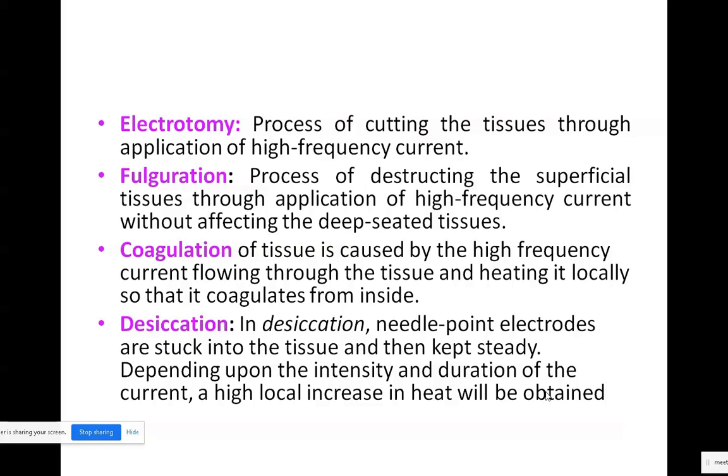So you'll be increasing, decreasing, increasing, decreasing based on our needs, doing the setup in the machine. Okay, that is the desiccation method. This is just for stimulating the tissue. That's why you'll be using the desiccation process.